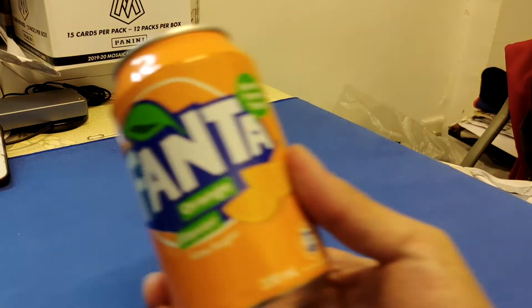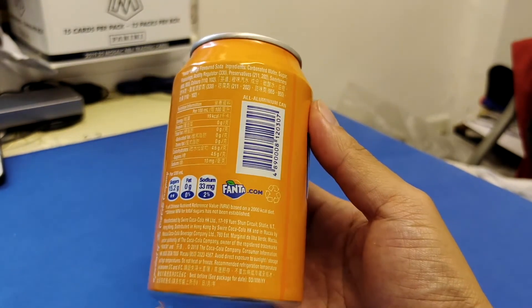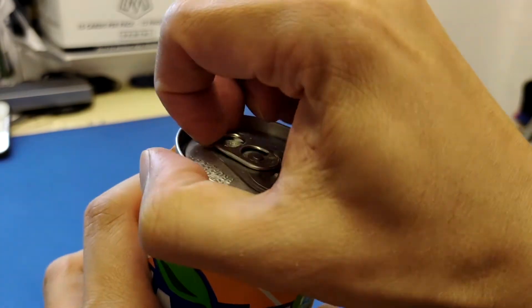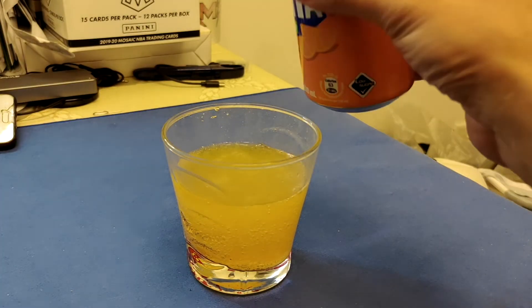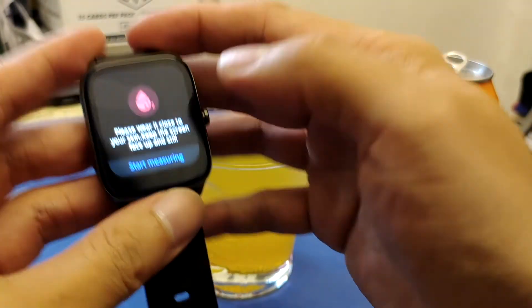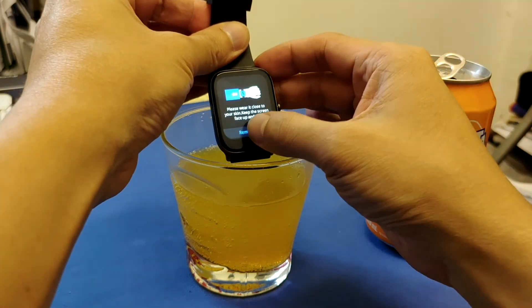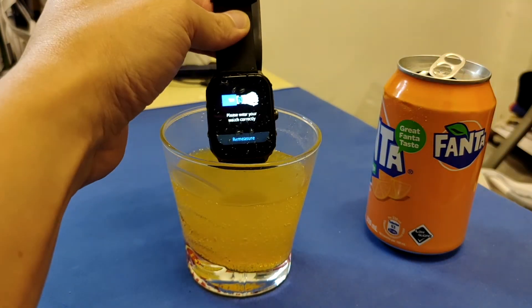I'm going to bring out a soft drink — I've pulled out a Fanta, which is one of my favorites, and it's low sugar. Let's open the Fanta and pour it into a glass of water. You can see a lot of carbon dioxide there — a carbonated drink with a lot of sparkles. Now let's try the smartwatch on it.